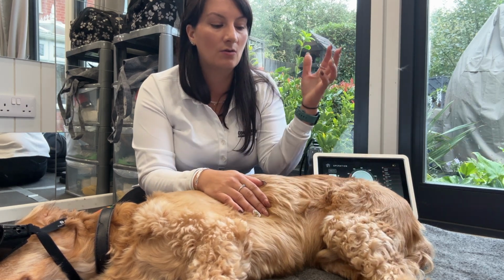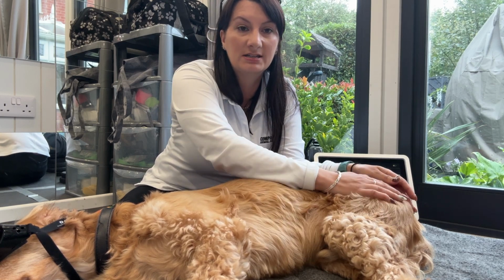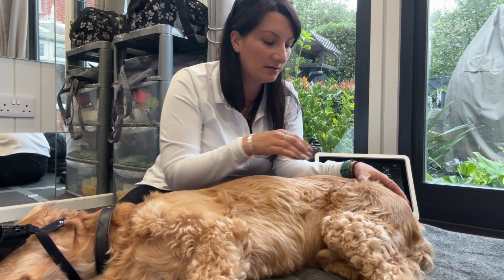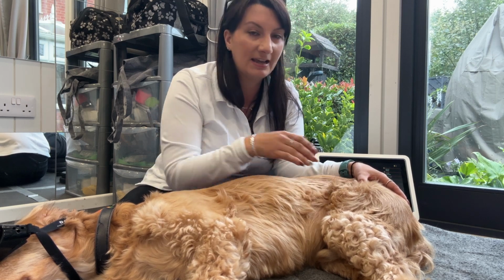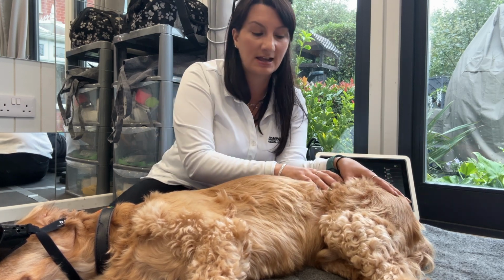So when it comes to treating the actual target tissue, let's, for example, for Vinny, I'm going to treat his hip. Now, he's got hip dysplasia. As I've mentioned before, he also has lumbar issues. He's missing a lumbar spine segment. His psoas is just never happy. So there's lots going on in this area.